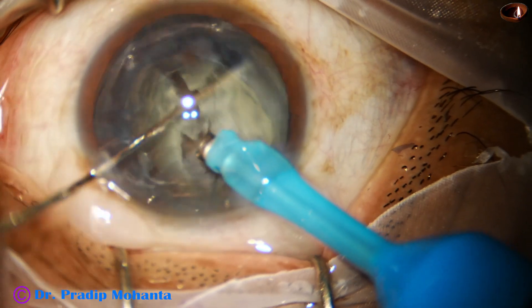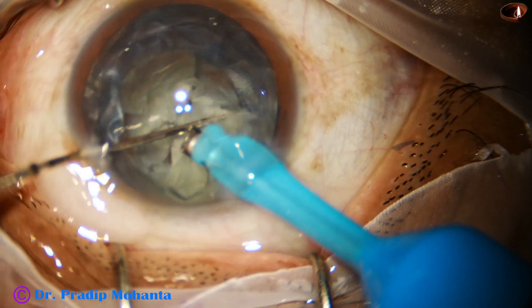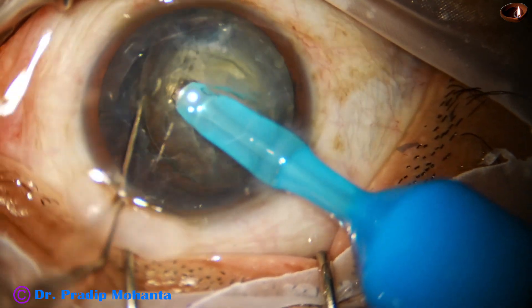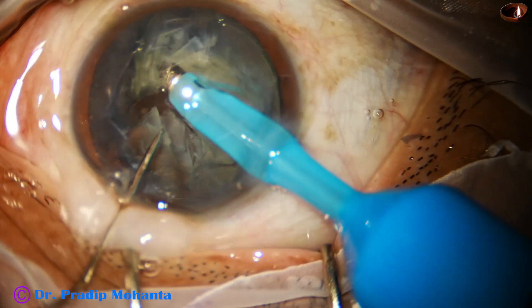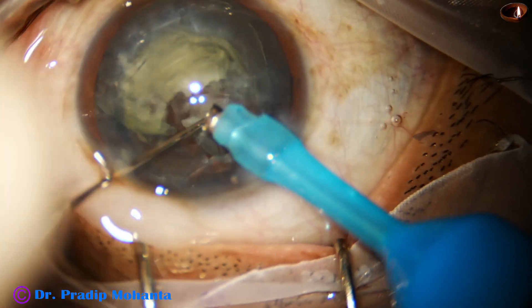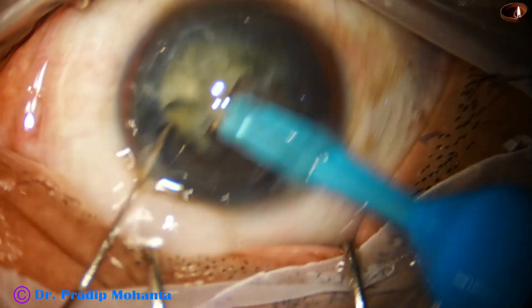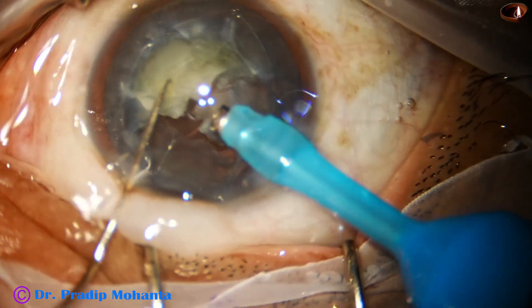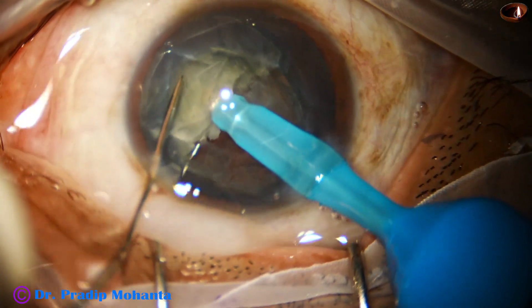She releases and comes to one hemi-nucleus and divides this hemi-nucleus into two pieces. Now she goes to the other hemi-nucleus. By this time the small two pieces are in the anterior chamber and she is removing those two pieces. Now she holds the other hemi-nucleus.